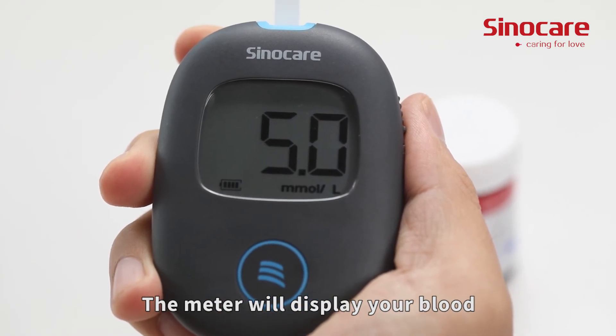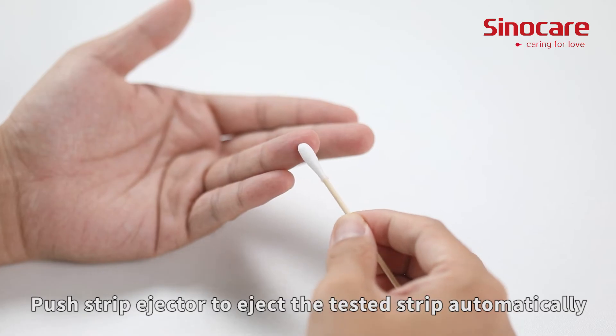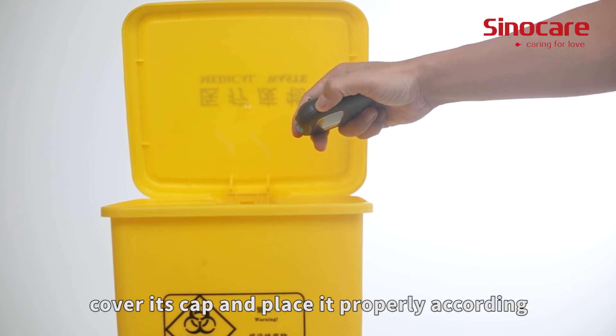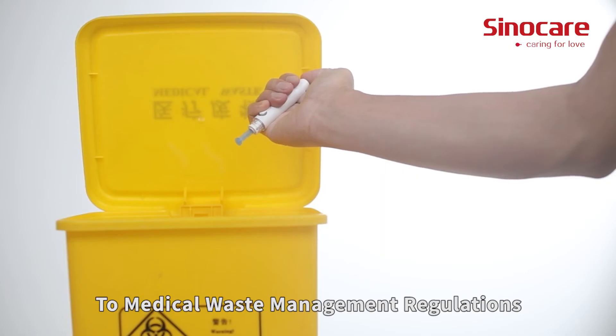The meter will display your blood glucose value after 5 seconds. Push the strip ejector to eject the tested strip automatically. Twist off the lancet, cover its cap, and place it properly according to medical waste management regulations.